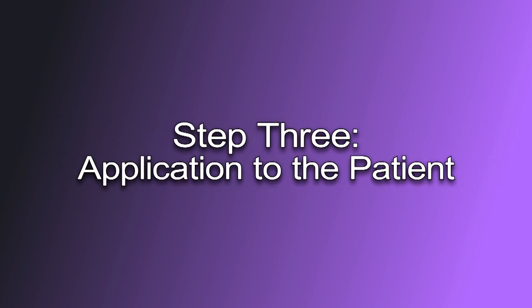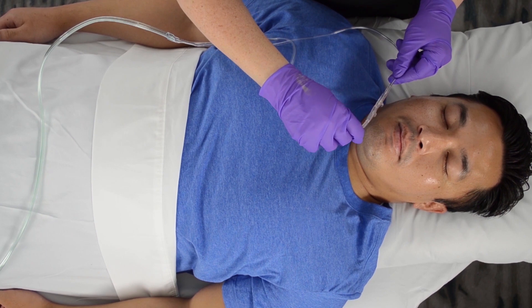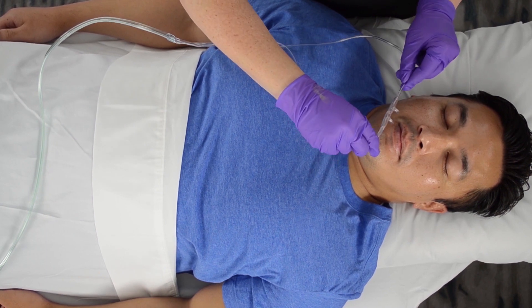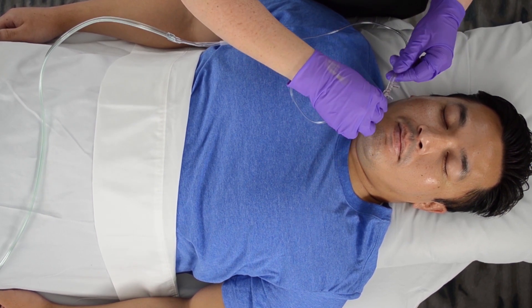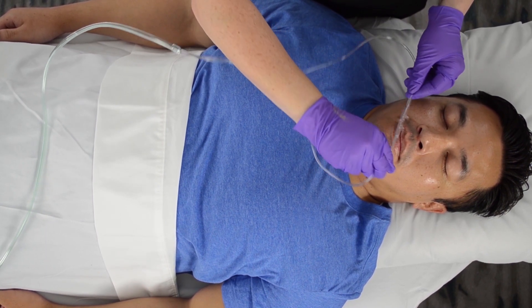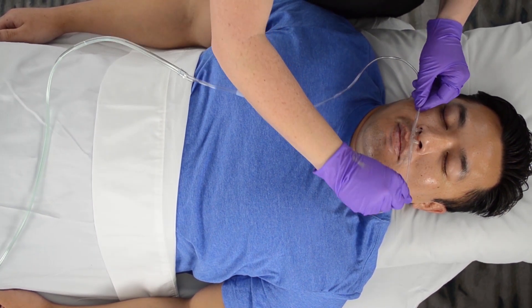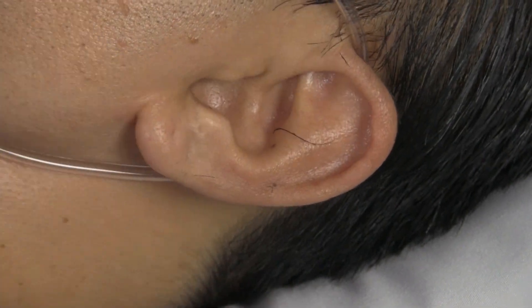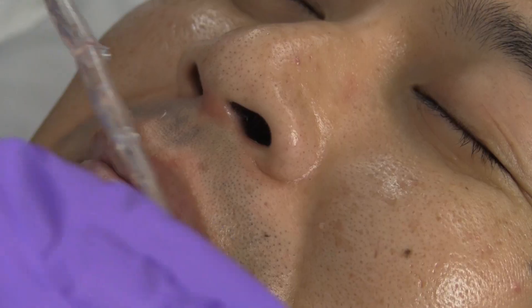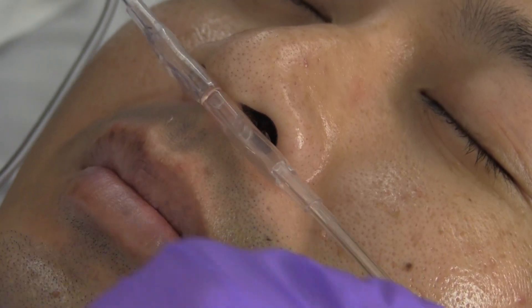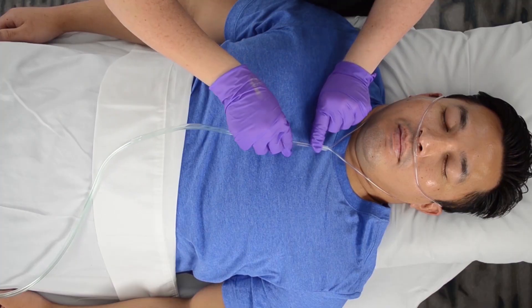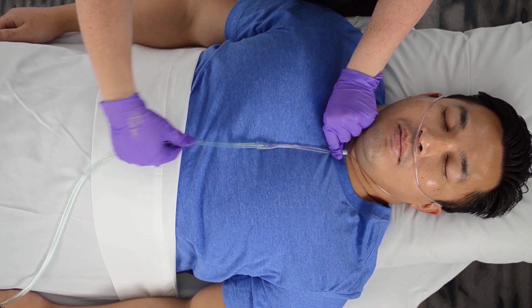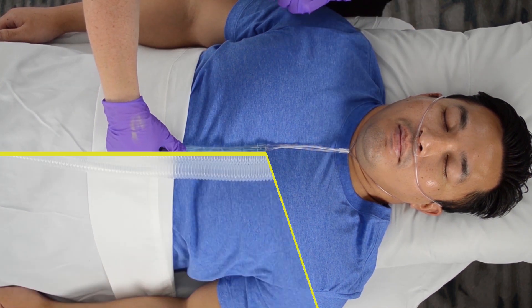Step three: application to the patient. Once the cannula has been attached to the sample line, the user will place the cannula on the patient. To apply the cannula to the patient, wrap the cannula's tubing around the patient's ears and insert the nasal prongs. Be sure to pull any slack to secure the cannula to the patient.